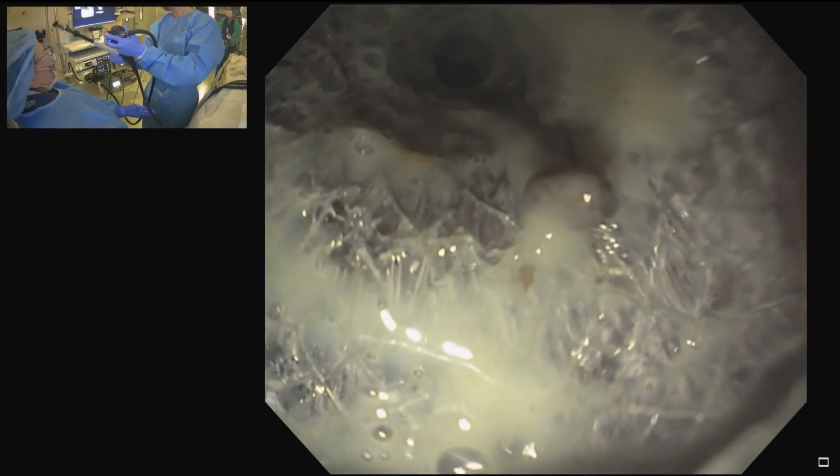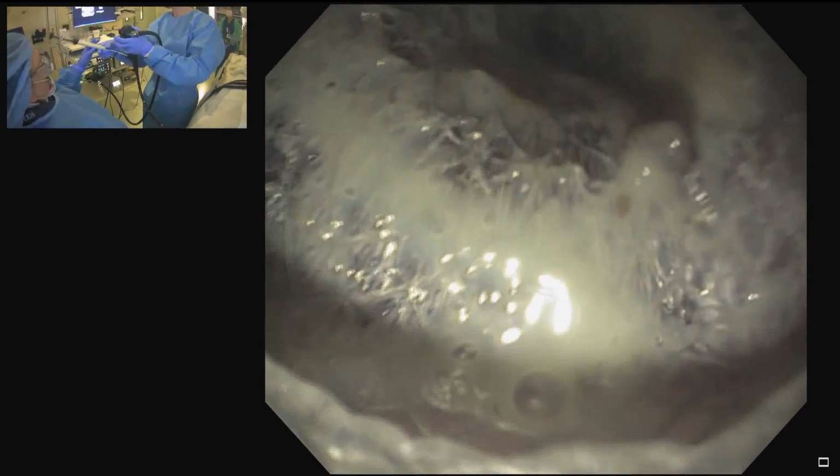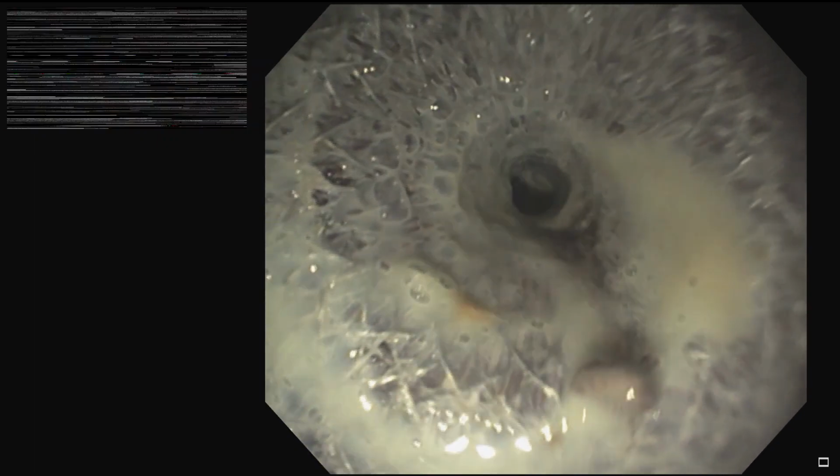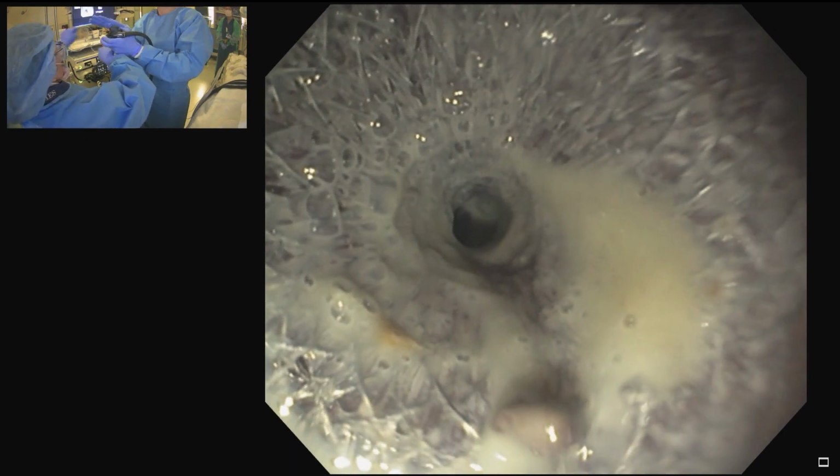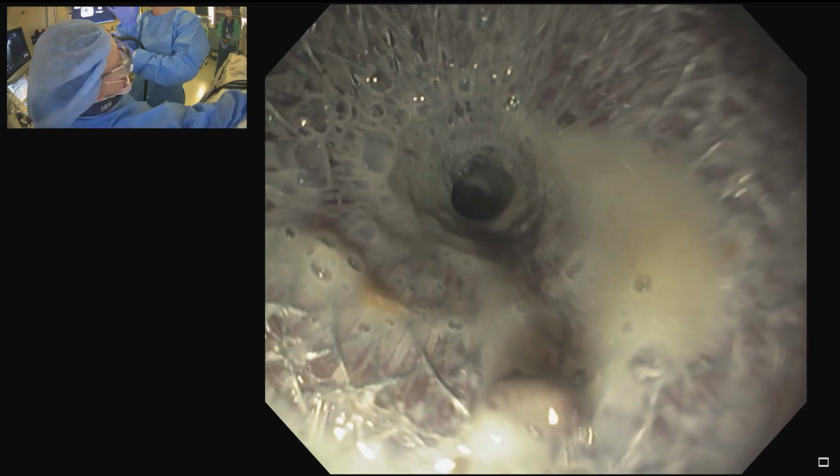Good. Now I'm ready to switch out for a CRE balloon, and I'm going to do this using the echo endoscope because I have a beautiful oblique view of this.